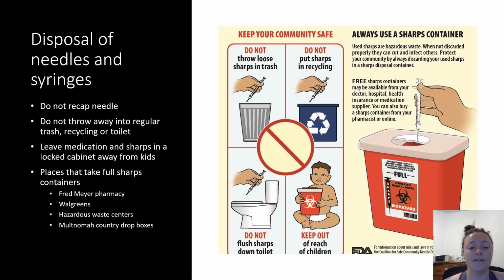And then disposing of the needles. So like I said, do not recap your used needle. Don't throw them in the trash. Don't throw them in the toilet. Make sure you keep this sharps container and all medications, all of the needle supplies, everything out of reach of children, preferably in a locked cabinet up very high.